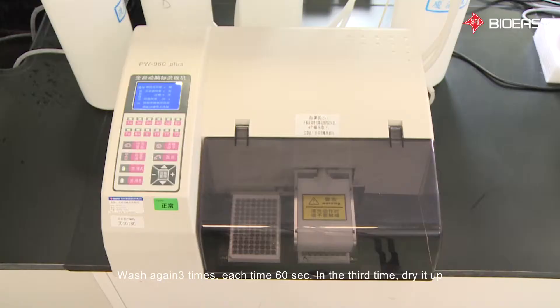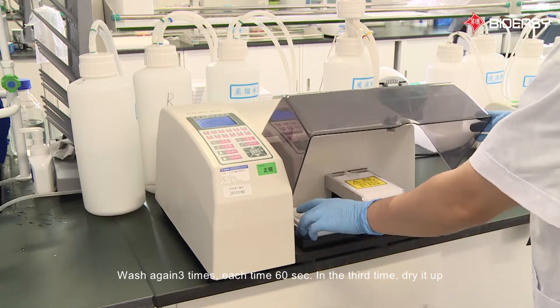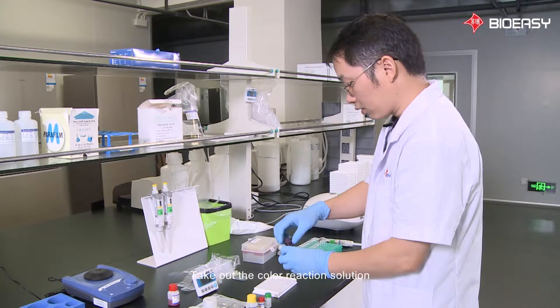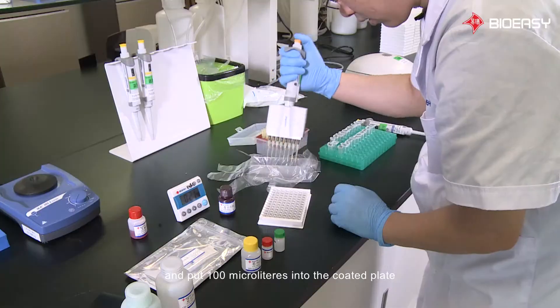Wash again three times, each time for 60 seconds. On the third time, dry it up. Then take out the color reaction solution and add 100 microliters into the coated plate.